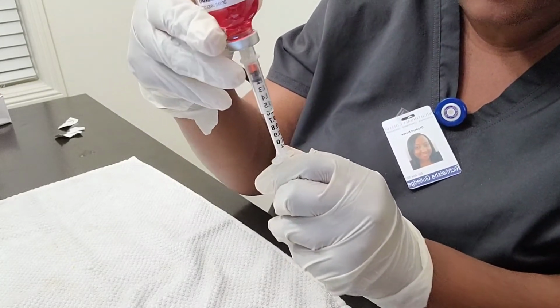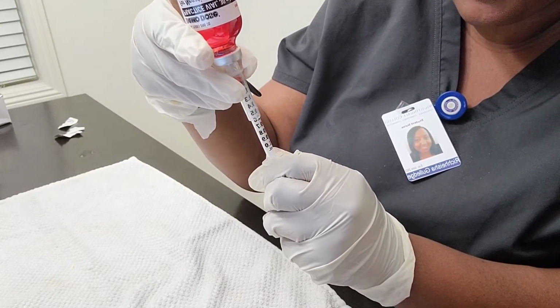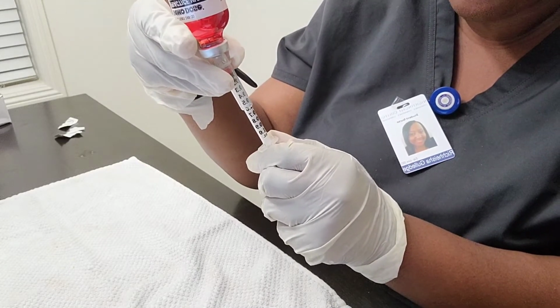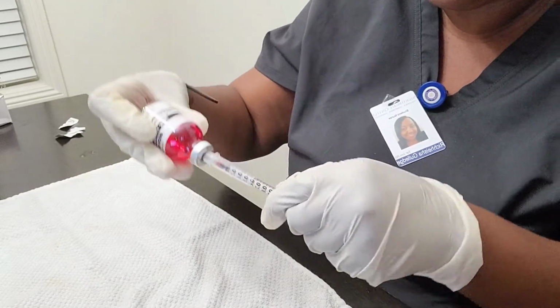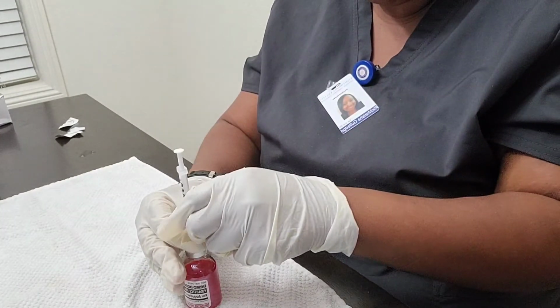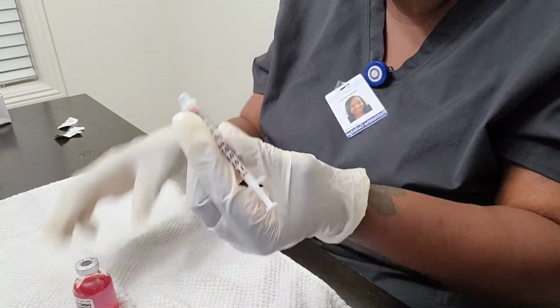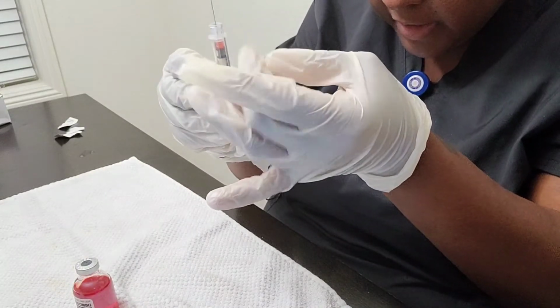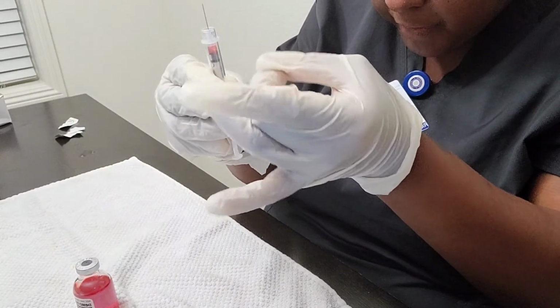Okay. So then I will go ahead and pour the medication into the syringe. Then I'll flip it back over and pull it out. And then I will tap it to get rid of any bubbles.